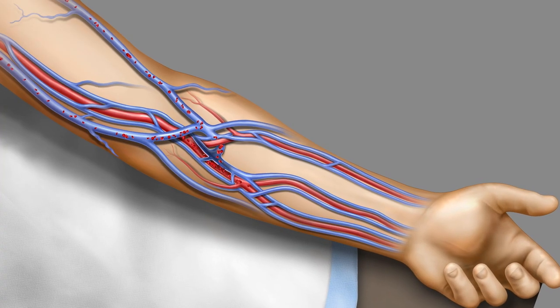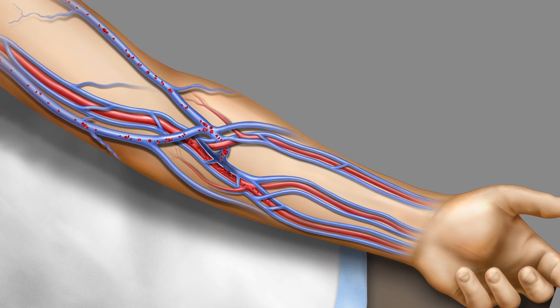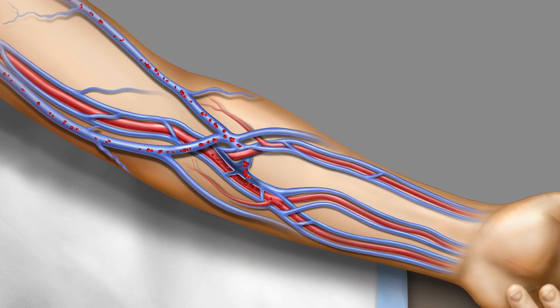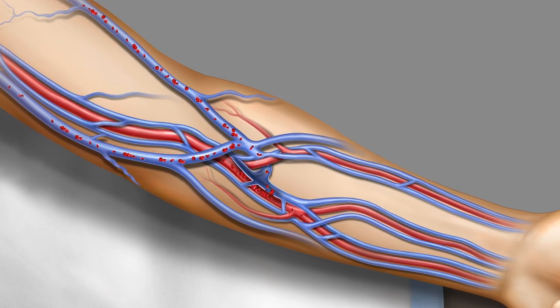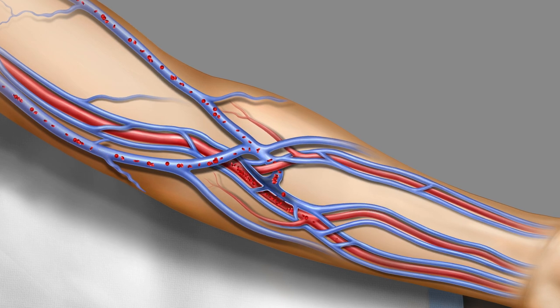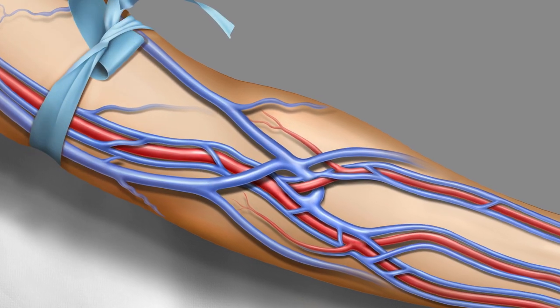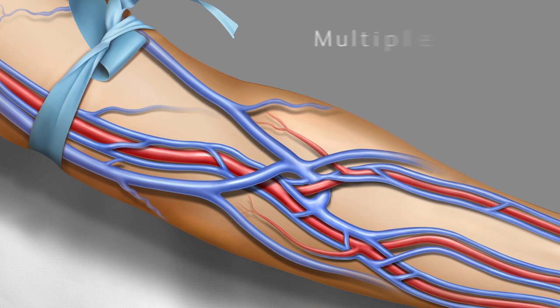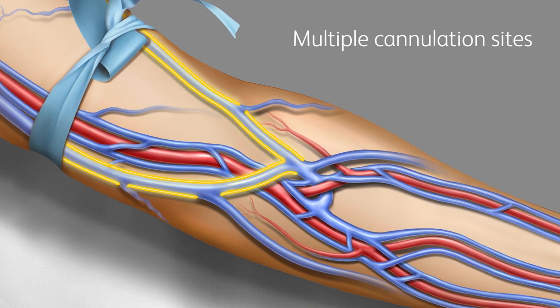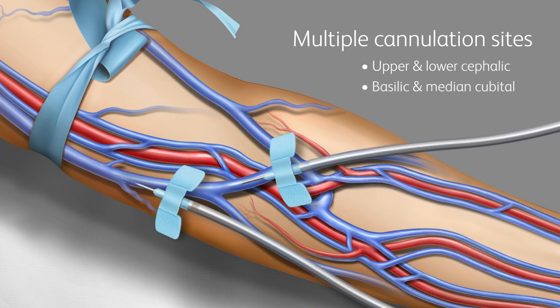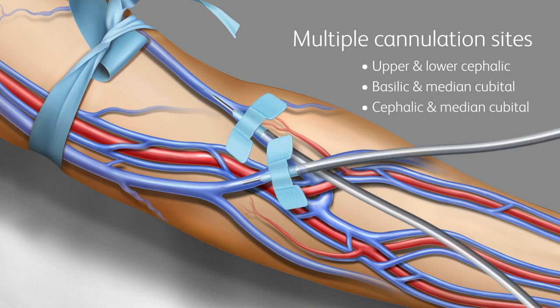Lastly, when a patient has more than one brachial vein and one of those is observed to have significant outflow, we recommend embolizing that brachial vein to promote blood flow to the superficial vessels. Over the next several weeks, the Endo-AVF will mature. Due to the nature of the anatomy, multiple outflow vessels may dilate. Keep this in mind when assessing the Endo-AVF for cannulation.